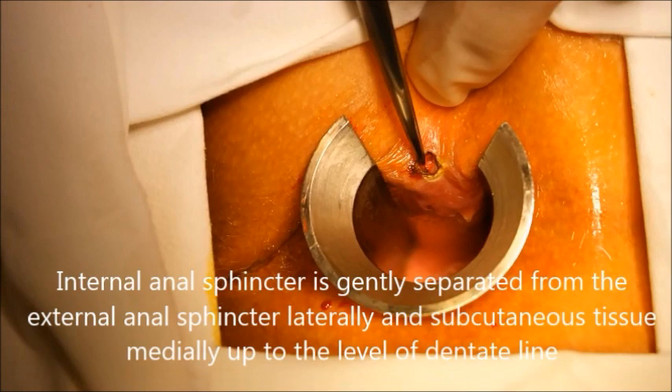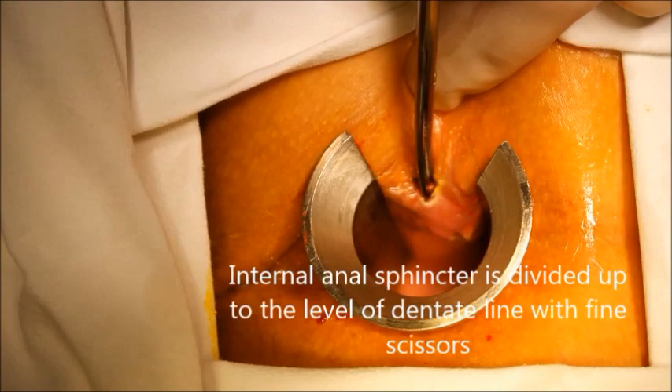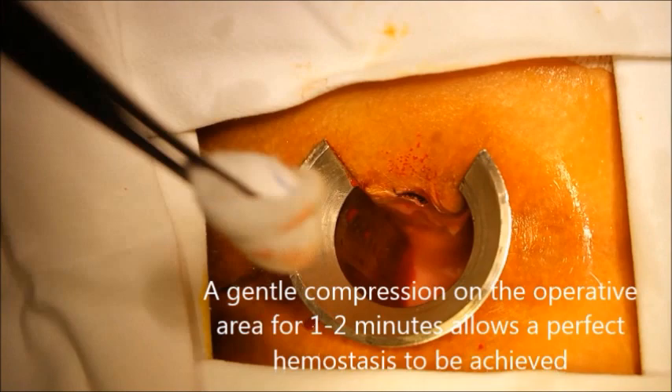Internal anal sphincter is gently separated from the external anal sphincter laterally and subcutaneous tissue medially, up to the level of the dentate line. Internal anal sphincter is then divided up to the level of the dentate line with fine scissors.